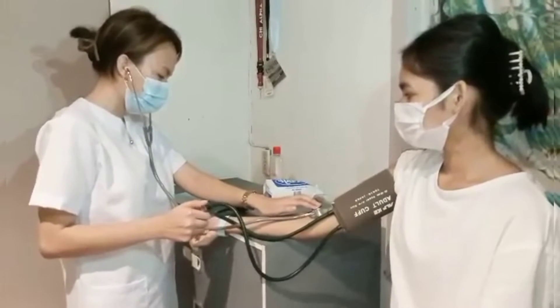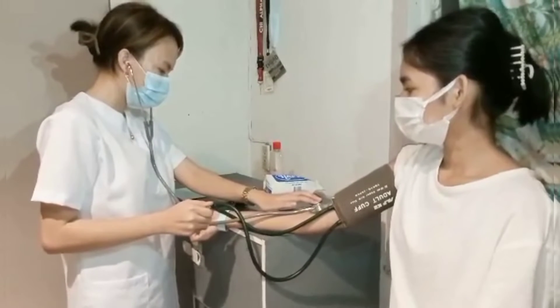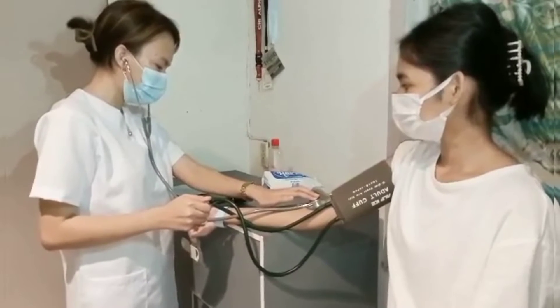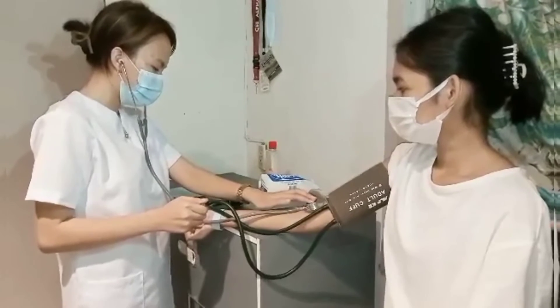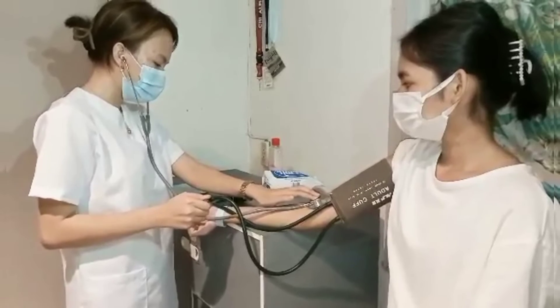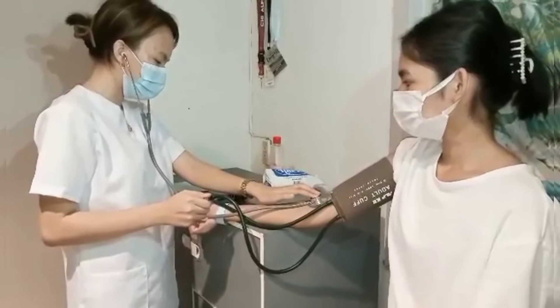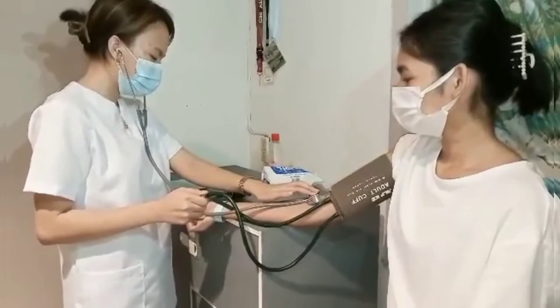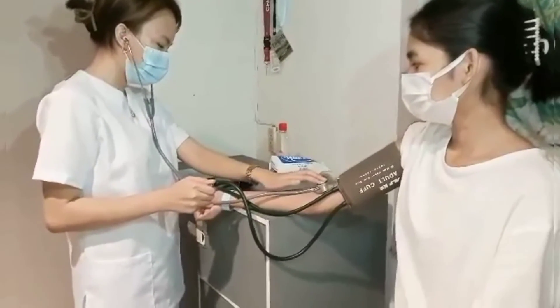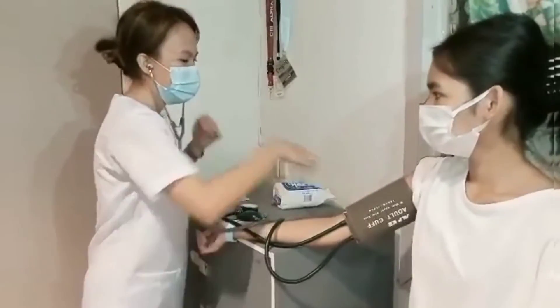Take note of the point on the gauge of the first sound, which is the systolic pressure, and also for the last sound, which is the diastolic pressure. Make sure to read the pressure to the closest even number. After that, release air entirely from the cuff and remove the cuff from the patient's arm.